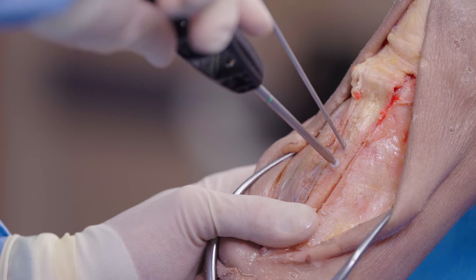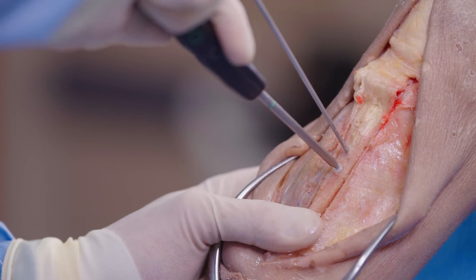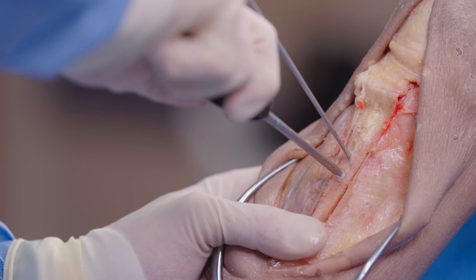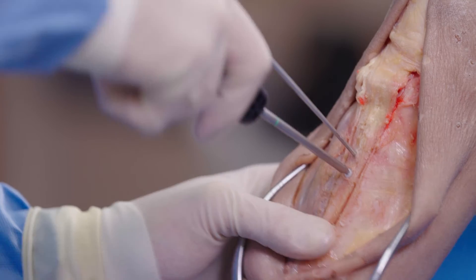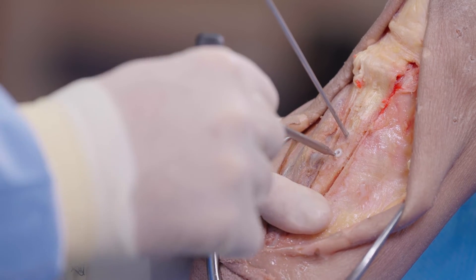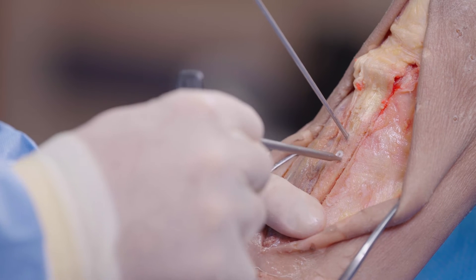It may not be picking up well on the video, but I'm getting a very nice, gentle squeak. I've got great compression — I can feel the bone block going down. And I'm down — it is flush with the surface, completely flush and countersunk. There is going to be no hardware irritation here.